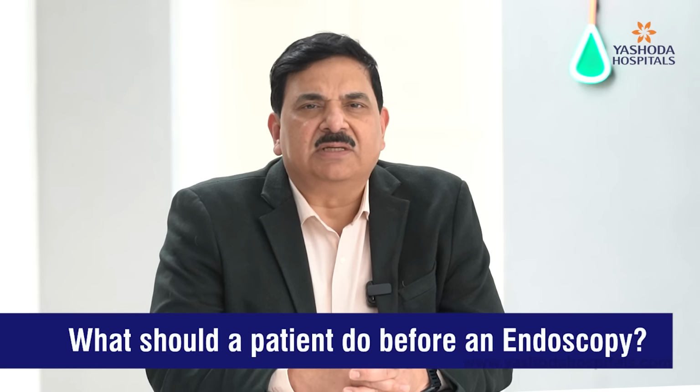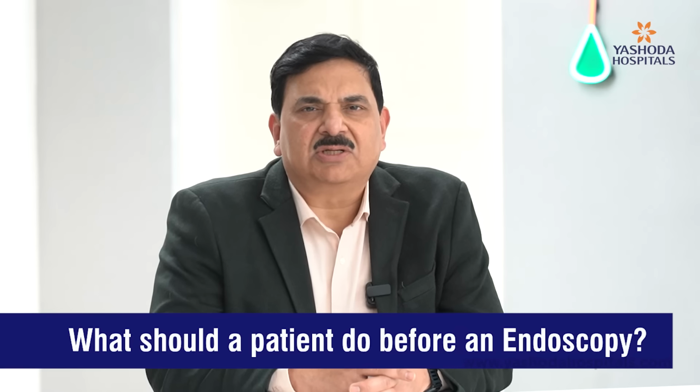So once an endoscopy is decided by the doctor, the patient will be asked to come on an empty stomach. The patient may be anesthetized. Usually nowadays it is better. The patients are given some sedation and they are monitored throughout the procedure. Monitoring means the cardiopulmonary status will be monitored by generally an anesthetist, and the procedure goes on under monitoring.